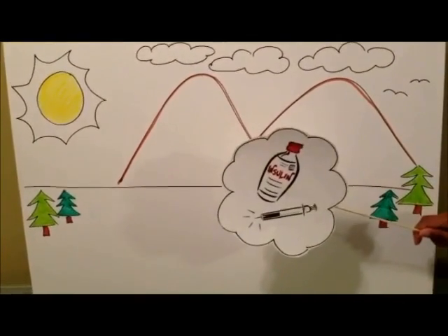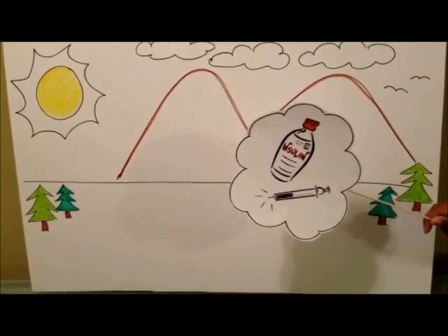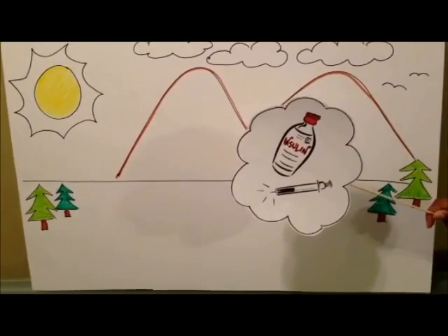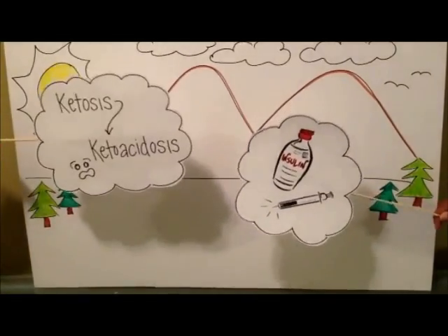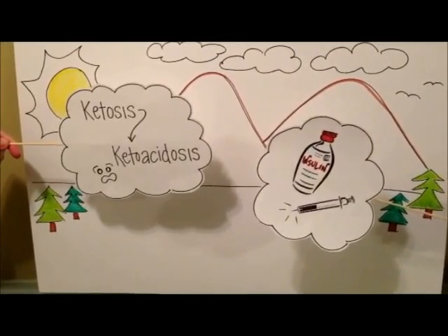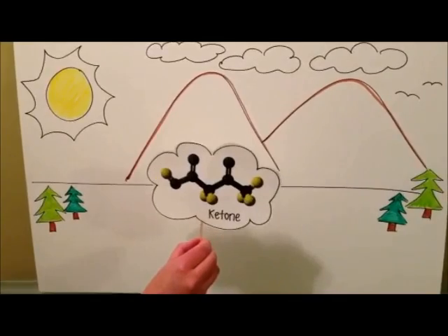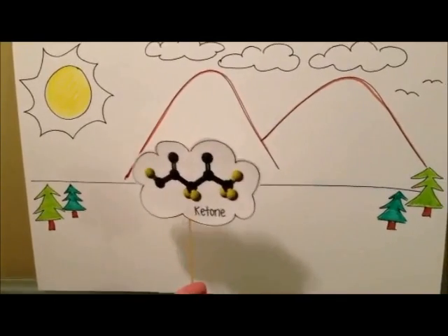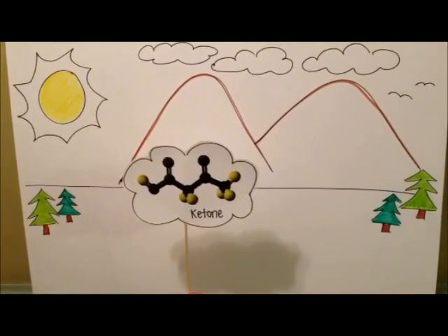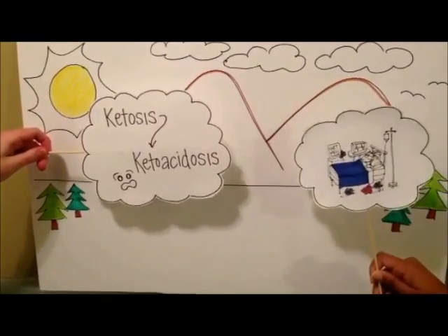For patients that have diabetes, Ketostix are useful in preventing possible fatal situations. Diabetic patients can use these to determine if they are at risk for ketoacidosis. There are times when diabetic patients could be burning too much fat and producing too many ketones. Typically, these are in times of stress, illness, infection, and during pregnancy. This can develop into diabetic ketoacidosis that can lead to a coma.